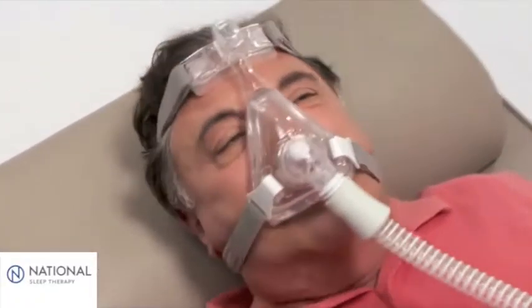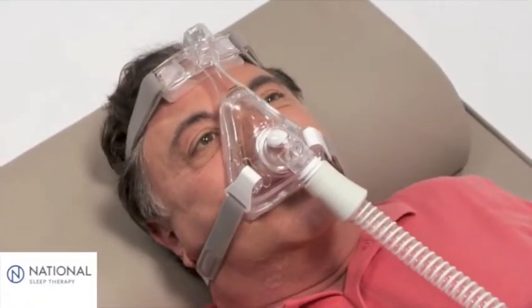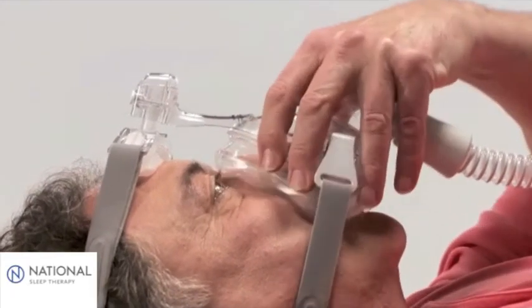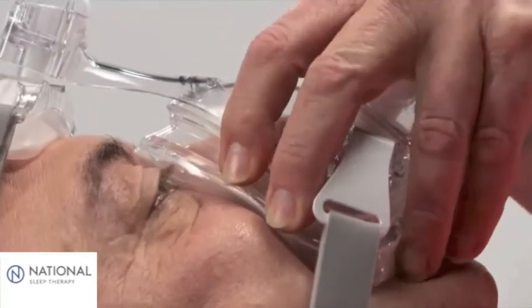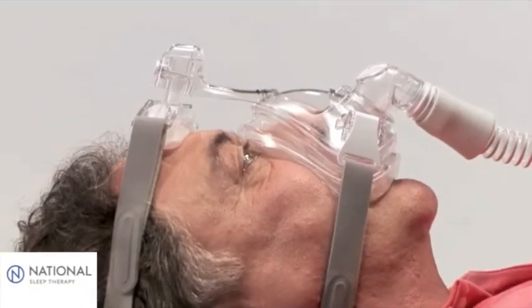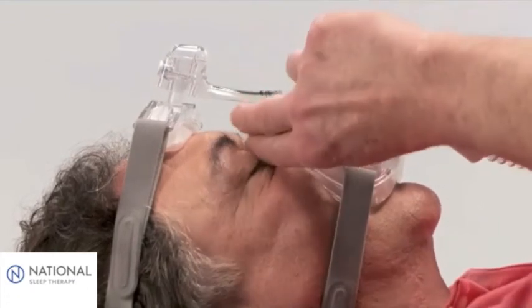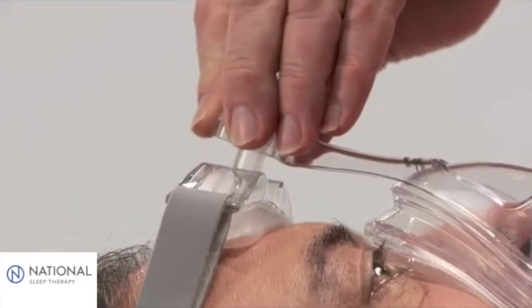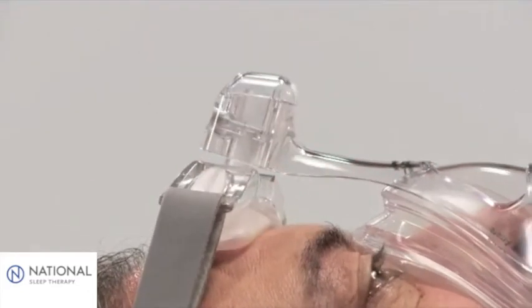In the event of leaks, there are various recommended methods to obtain a better seal. First, reseat the mask by pulling it directly away from the face and gently setting it back into place. This allows the cushion to create a new seal. To address leaks around the bridge of the nose or into the eyes, press and hold the fine glide adjuster to increase pressure in this area.